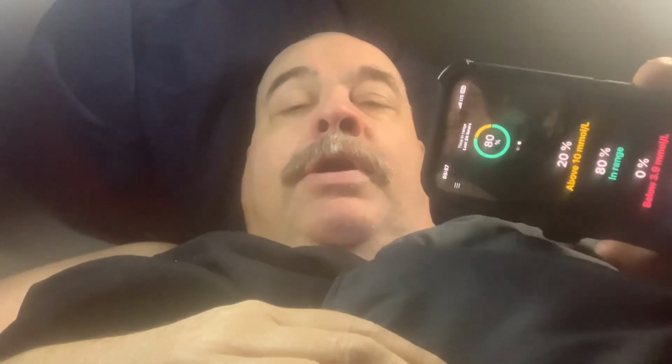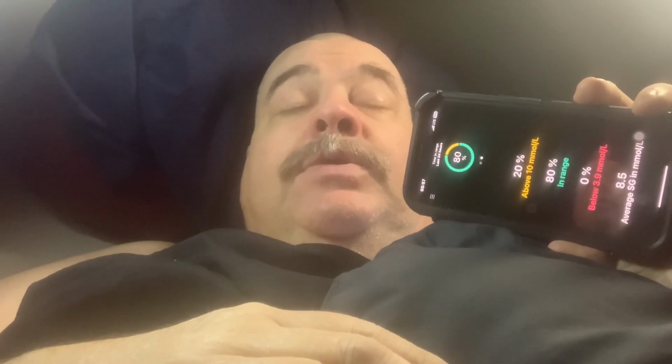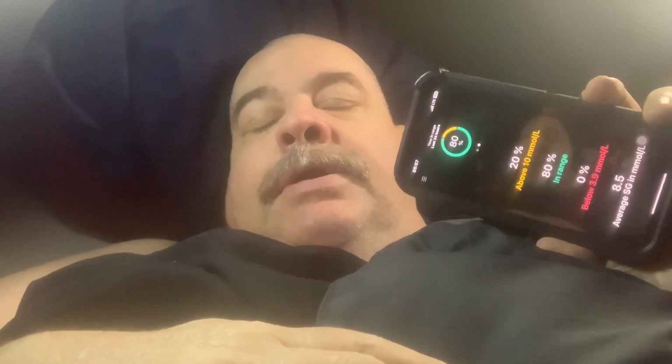Okay, CGM is wonderful. It is pricey though, I will tell you that. Doesn't matter if it's this, if it's Dexcom, it's all pretty pricey. So people are going to try to extend the wear. Now, Medtronic's sensors currently are at a 7-day lifespan. Dexcom, I believe, is at 10. For me, not making any excuses, the 7 days works well. That way I can remember every week I have to change it.